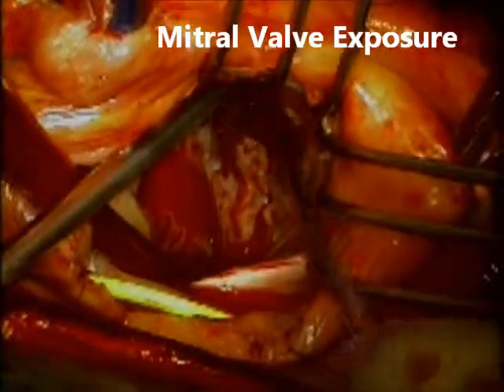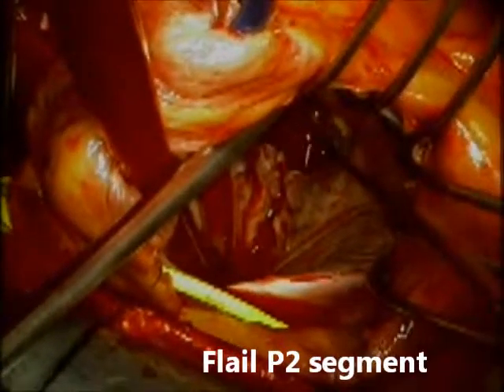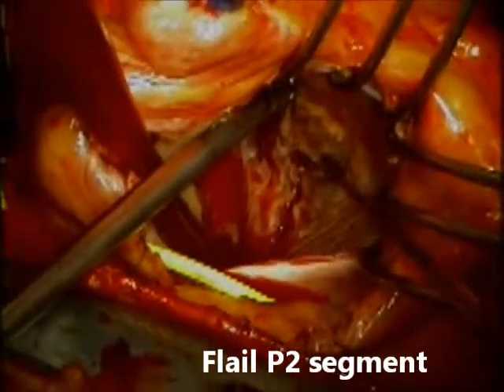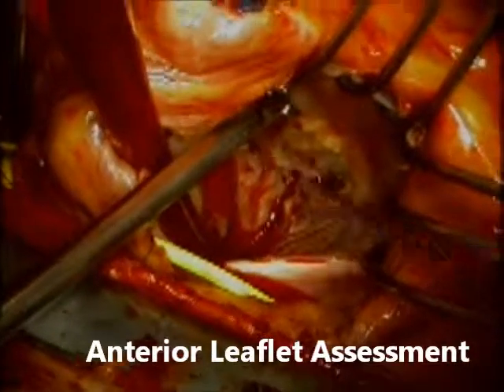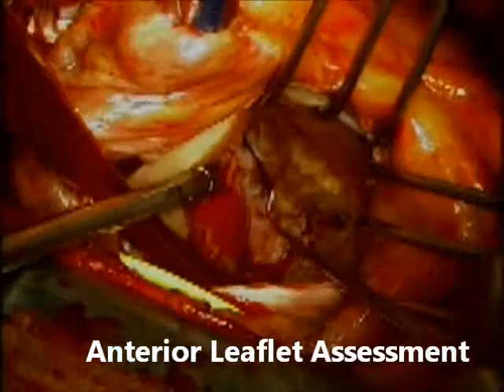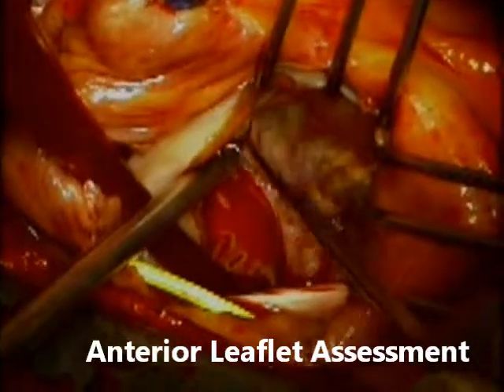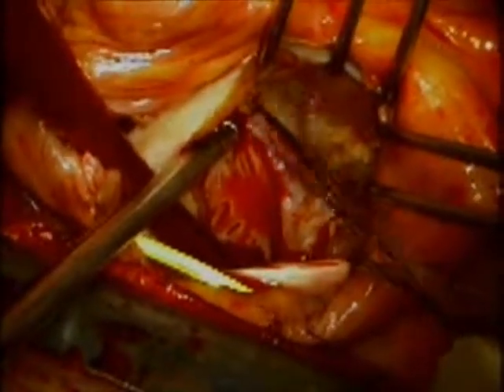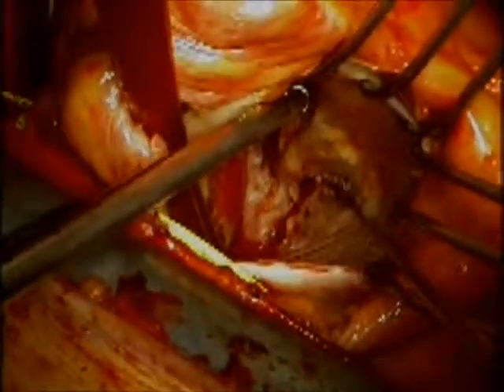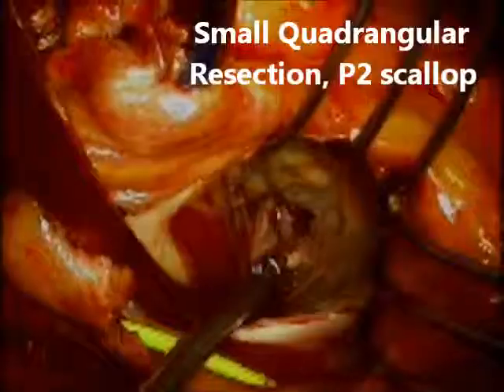The next step is to assess the mitral valve. I am looking at the flail segment on the P2 scallop — you can see the small cord still attached to the scallop. I then proceed with assessment of the anterior leaflet. With a nerve hook I am isolating each chordal attachment between the anterior leaflet and the ventricle to make sure there is no portion of the anterior leaflet that prolapses above the coaptation plane. In this case the anterior leaflet is still fairly flexible, though there is a small area of calcification between the mitral annulus and the anterior leaflet.